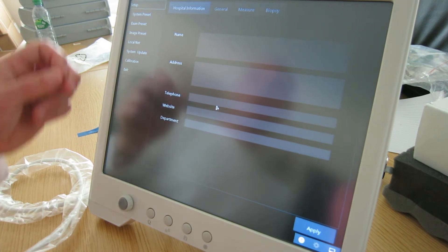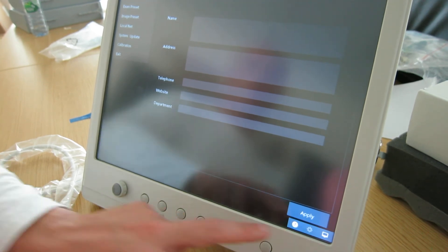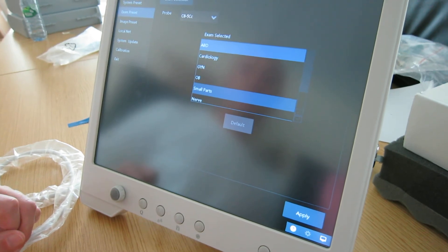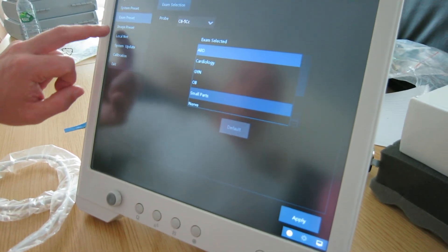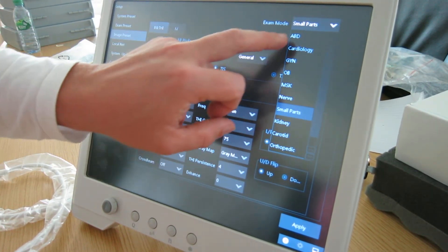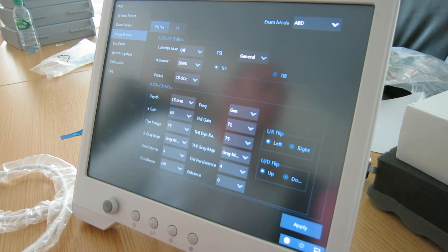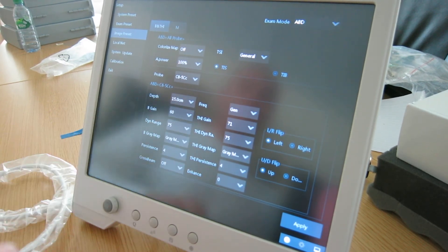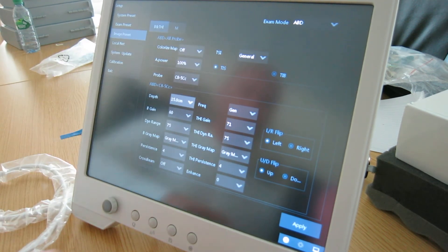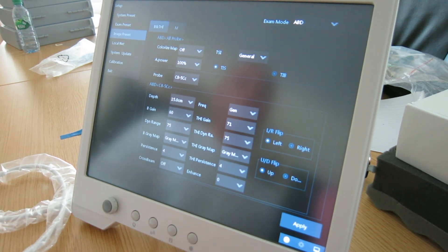One other thing — in the bottom right hand corner, once you're in scan mode, there's the setup options and you can do image preset. In image presets you can choose the exam mode in the top right hand corner, for example abdomen, and then specify your presets for that scanning for your optimal settings. Very simple, one touch, just to change the options and choose your requirement. Press the supply button. That is just a quick overview of the VI ScanPad.